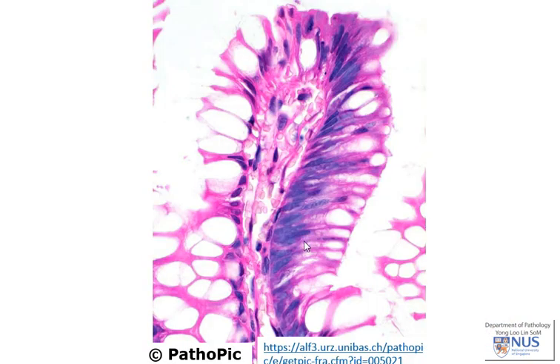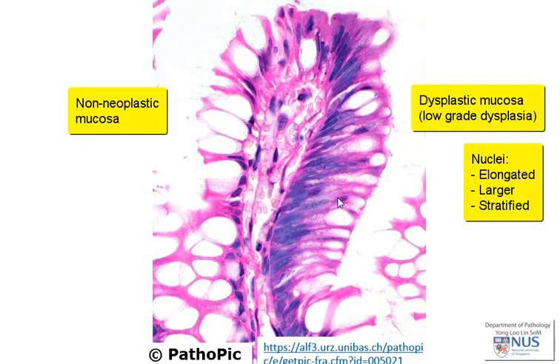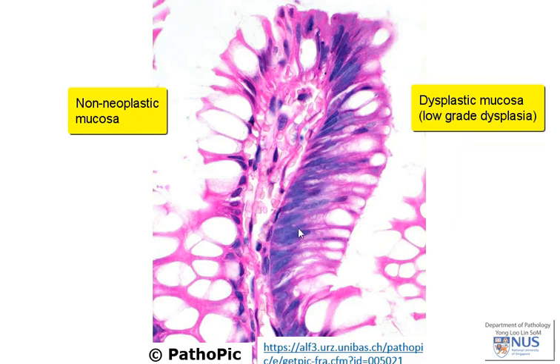Moving on to a very high power view, this is a single villous. On the left side we can see normal colonic mucosa with goblet cells and very small basal nuclei. There is an abrupt transition, and on this side the nuclei are a lot taller - elongated and oval - and they are stratified, located in the middle part of the length of the cell or approaching the luminal surface. This nuclear stratification represents low-grade dysplasia. In high-grade dysplasia, the NC ratios are even higher and the nuclei appear more rounded with prominent nucleoli.